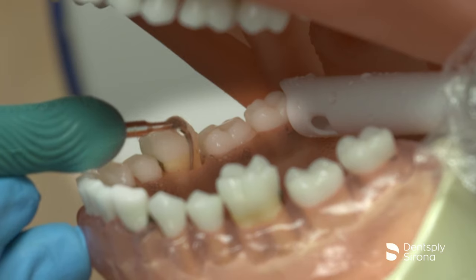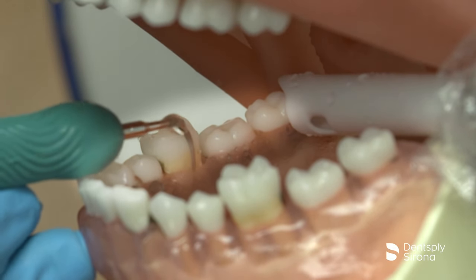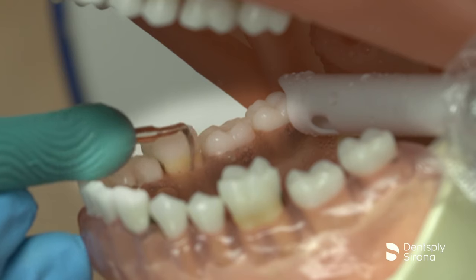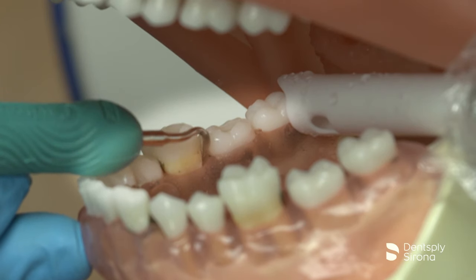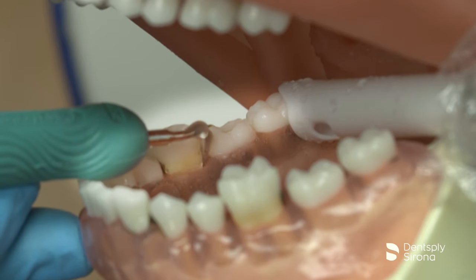As seen here, the curved left insert is following the anatomy into the furcation and is maintaining the necessary two to three millimeters of adaptation. Proper adaptation is required to navigate the interproximal space successfully. A slight turn of the insert maintains adaptation around the line angle and assists the clinician to successfully debride the periodontal pocket.